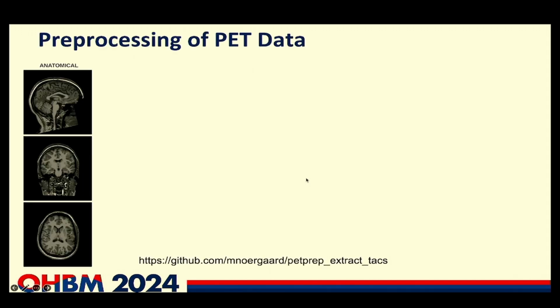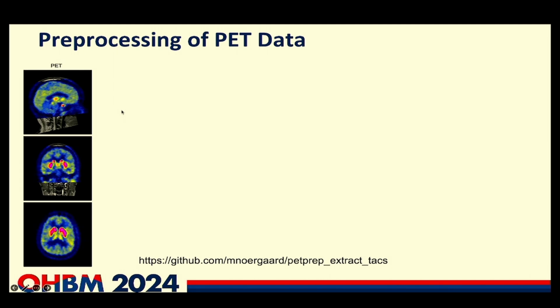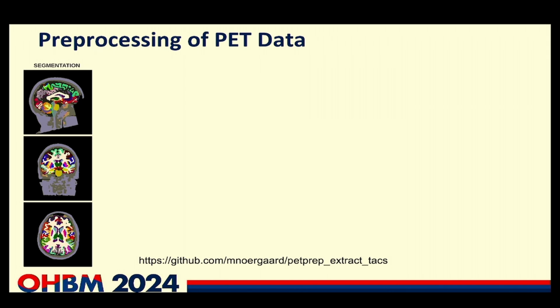And basically what it's doing is that it's taking the anatomical data, it's registering the PET data to the MRI, it's doing segmentation for the MRI, mostly using, at least for now, region definitions defined by FreeSurfer, which are subject-specific segmentation. We're also working on including that you can basically come with whatever segmentation that you want, so it's up to you what you want to do.